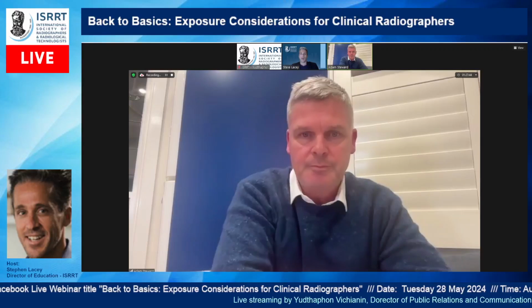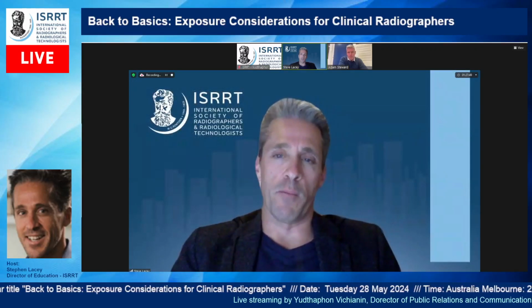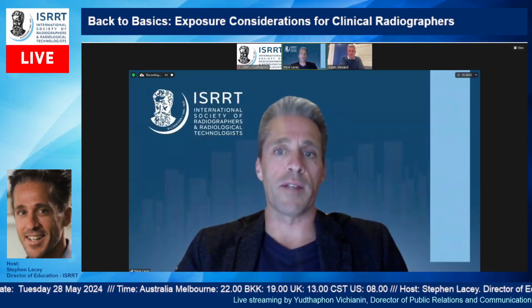Yeah, and I think you're right there, and it's good to know that it's more vendor neutral as opposed to the EI, because with your EI and your SI values, they do differ depending upon which vendor you're using. So something that's consistent along the different vendors is very helpful, particularly for those working in places where there are multiple vendors in the same area.